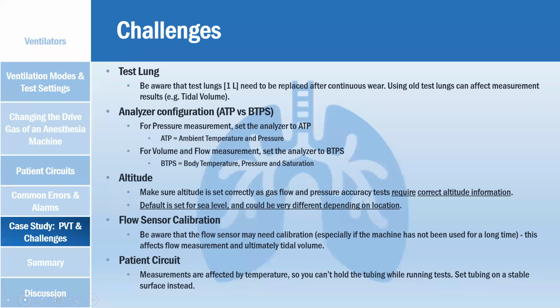Okay, when you talk about the challenging part, I did mention about the test lung earlier. So beware of the test lung. Sometimes it has been used a long time, sometimes you don't use it very long.